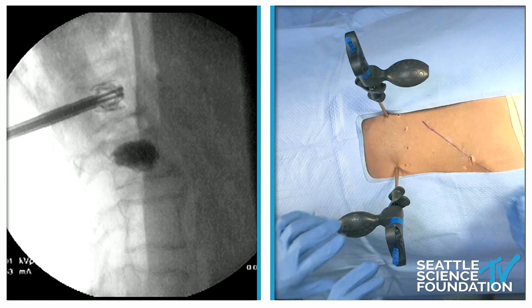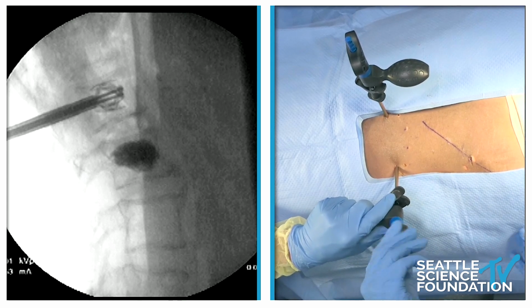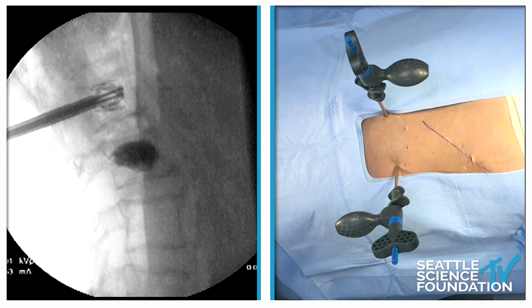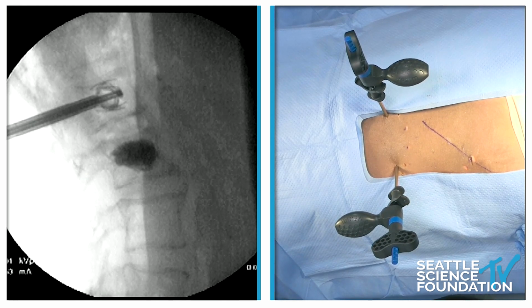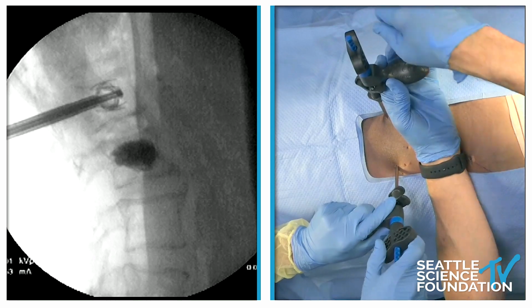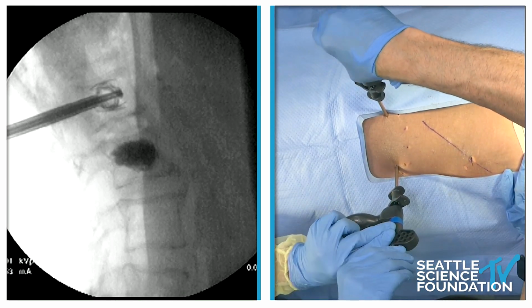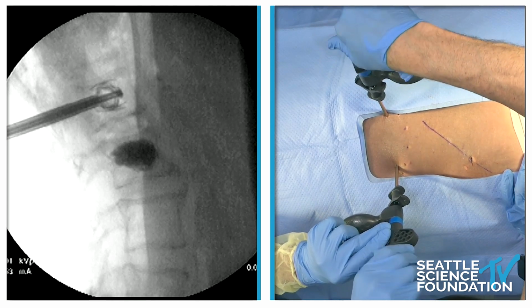And so once we go to a hard stop, it goes all the way to a hard stop. And what we'll do, we'll take a picture of it. And very nice, very symmetric. Then we'll back off a couple of turns. And then once we do that, it relieves the pressure. And then we'll unscrew the colored knob. And that's 10 turns to do that.